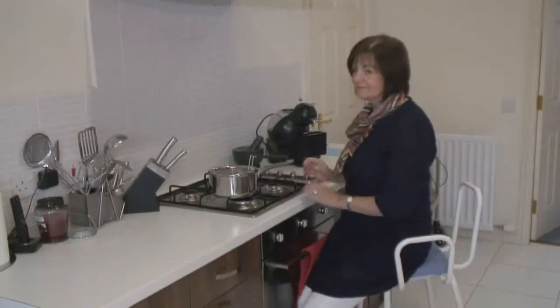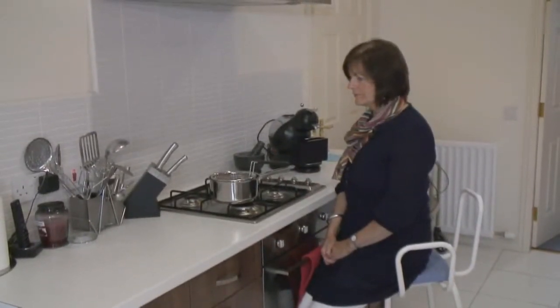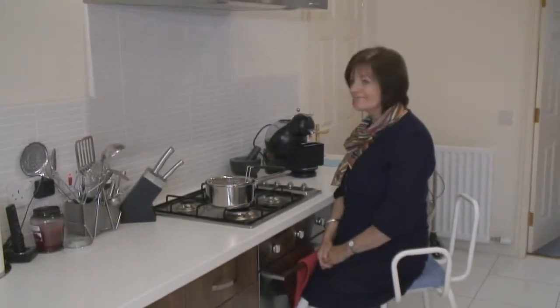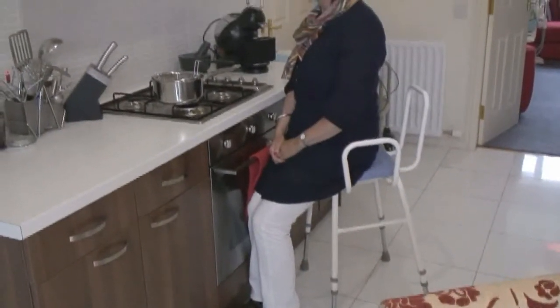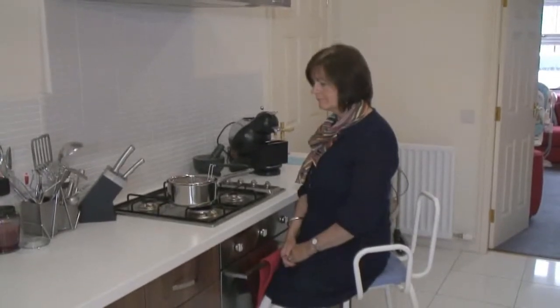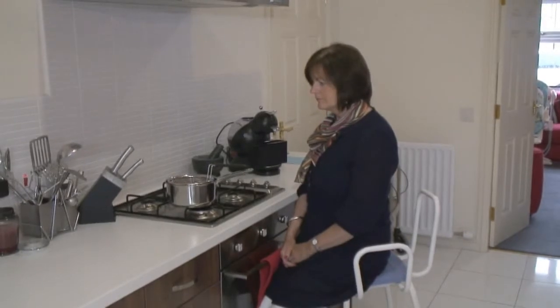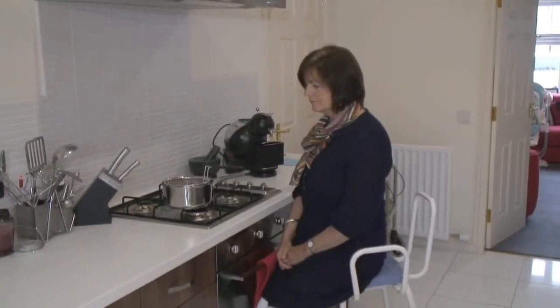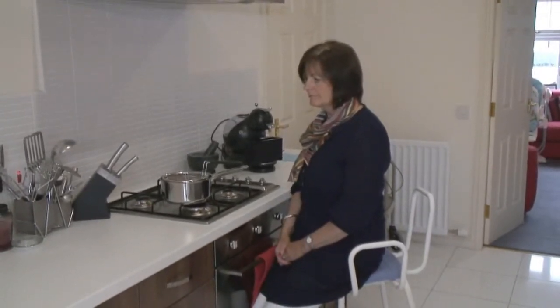In this section we're going to look at a few items of equipment that can make it a little bit easier to maintain your independence in the kitchen. Brenda's sitting on a perching stool. Often when people try to use an existing, say, dining chair and sit at the table to do any activities in the kitchen, you'll find that you're too low and too laid back to be in a functional position. So a perching stool does just that. It allows you to perch, so it keeps you in a much more upright position.